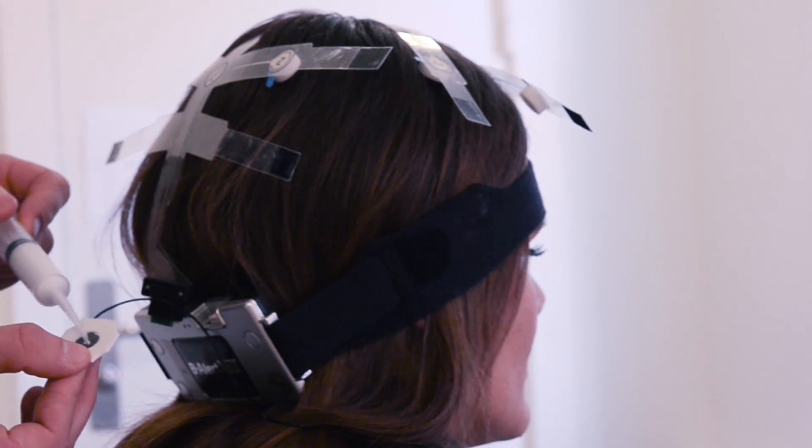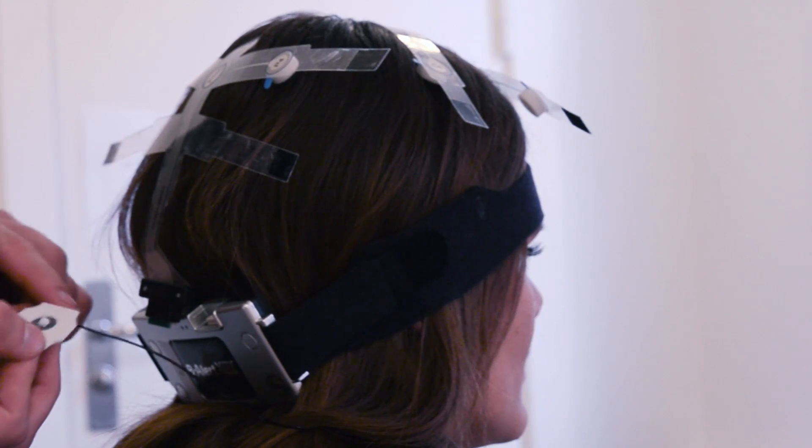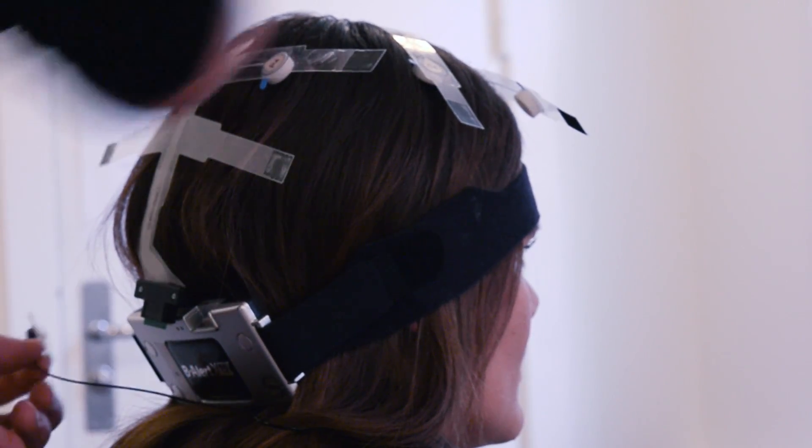When that's in place, we put another passive electrode behind each ear to serve as a reference point. This is done to help getting the desired connection.